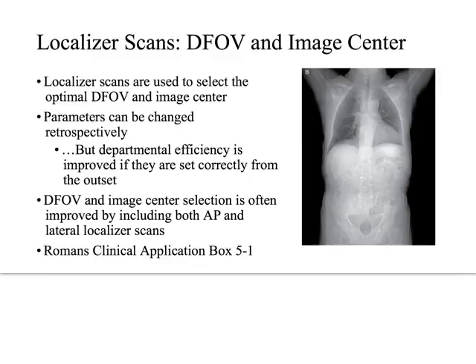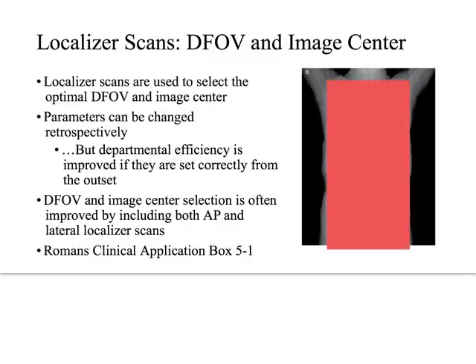But the way that we are going to use it primarily as technologists is we will now input the area that we want to scan off of this localizer image. So regardless of where the ISO center might be, most scanners, the way they work is they allow you to draw a box. And the box situation works like this. It's just like making a box on any other kind of image. You'll be able to draw, let me see if this will let me do it, draw it on there like this.